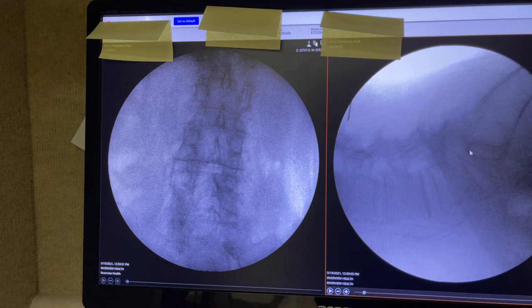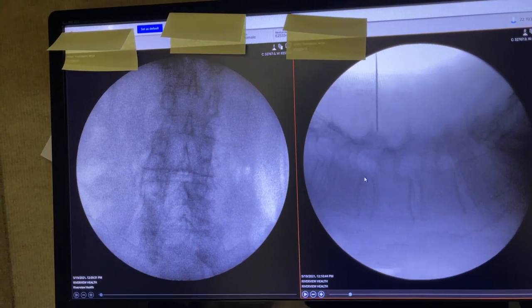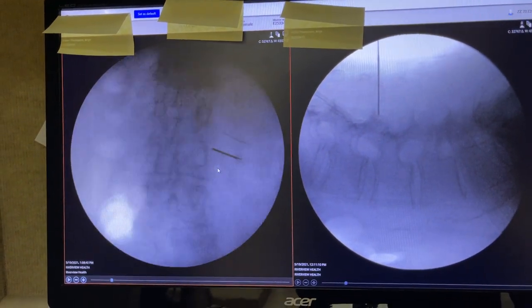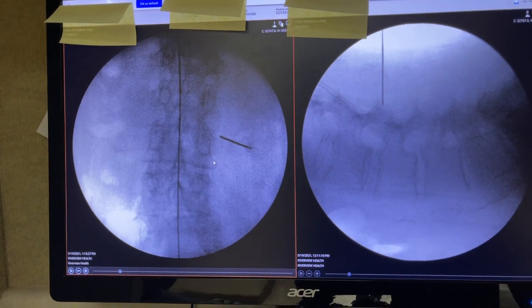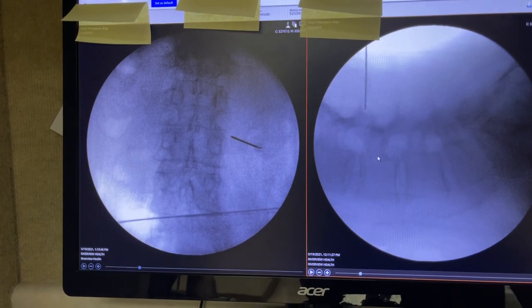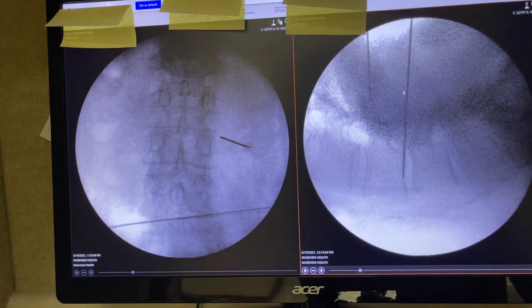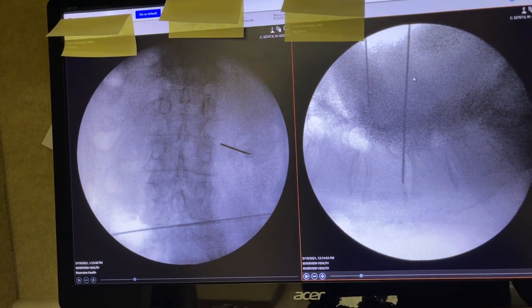We are adjusting for the level of interest and going to start with the 3-4. We are going back and forth until we find the good 3-4 picture. We find the best picture, align it, get the anatomical AP of the patient and mark it on the skin, then the trajectory of the disc and mark it on the skin. On the lateral view, we get practically the disc trajectory and mark it on the skin from here to the dome of the back of the patient.